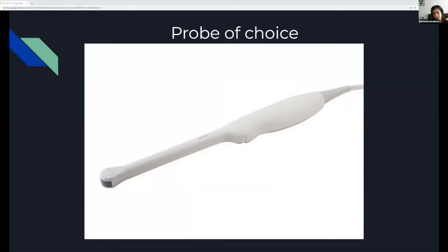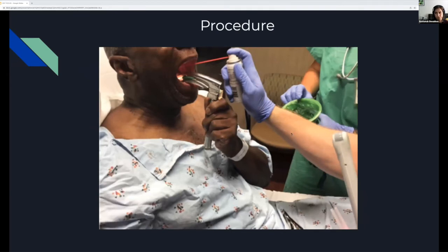There are two techniques and I'm going to show both of them. The probe that will help you most is the intracavitary probe. You put a probe cover on it, go into the mouth, and place it directly where the swelling is, scanning in the appropriate orientation. You can do it ultrasound-guided, or just use ultrasound to confirm there's an abscess. The mouth cavity is a small space to work with, so you want to maximize the space you have.